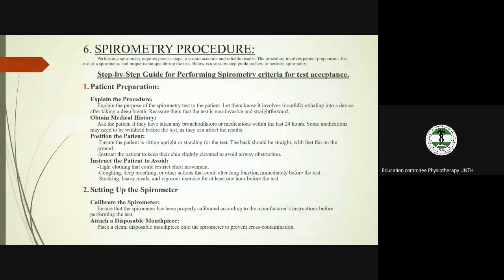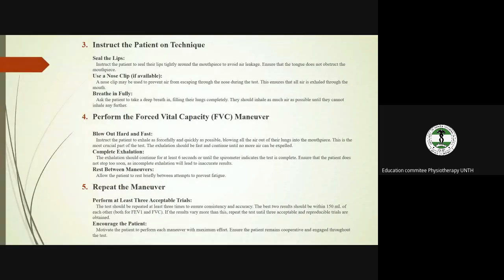Then instruct the patient on the technique, what you're about to do. You direct the patient on what to do. With the spirometry mouthpiece, you should guide the patient. Take enough air into the lungs, then you blow out. Then with motivation, you help the patient.